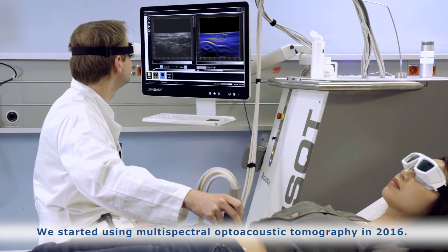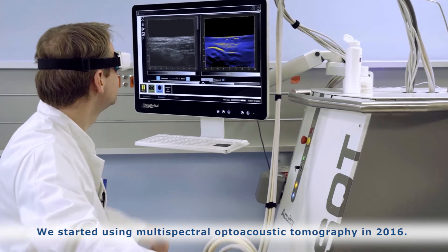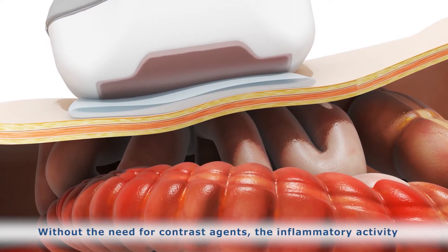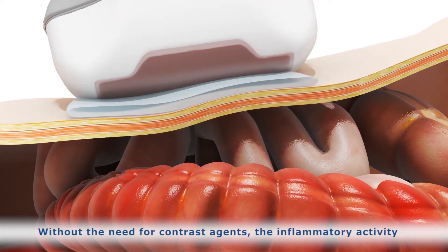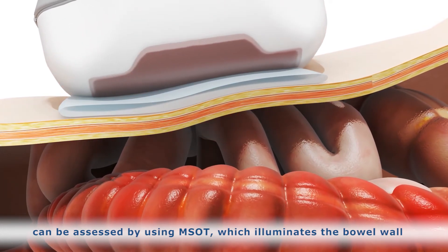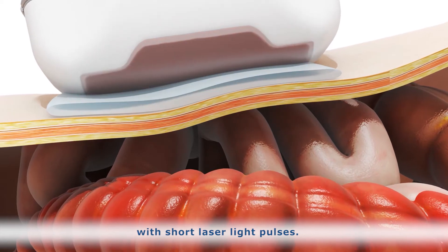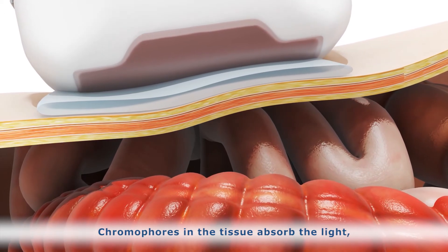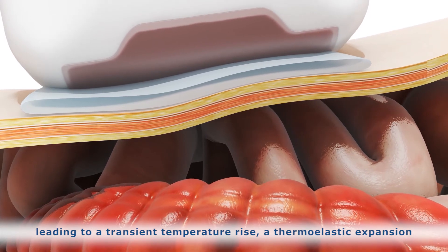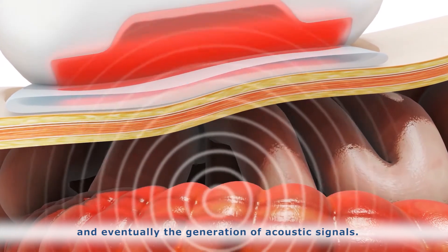We started using multispectral optoacoustic tomography in 2016. Without the need for contrast agents, the inflammatory activity can be assessed by using MSOT, which illuminates the bowel wall with short laser light pulses. Chromophores in the tissue absorb the light, leading to a transient temperature rise, a thermoelastic expansion, and eventually the generation of acoustic signals.